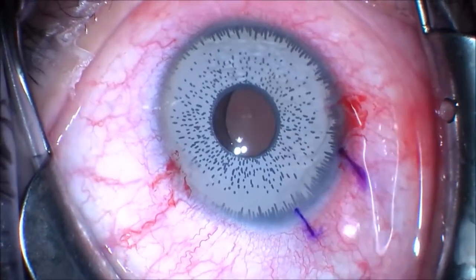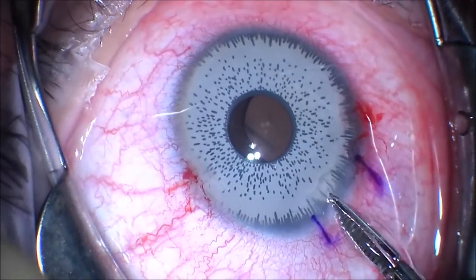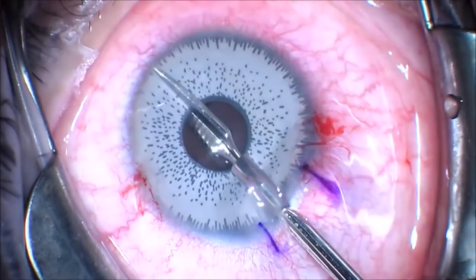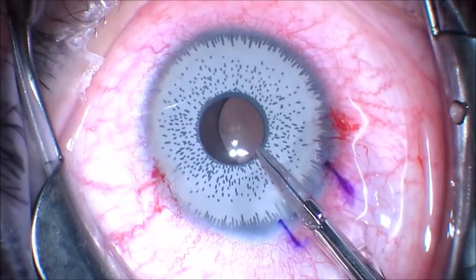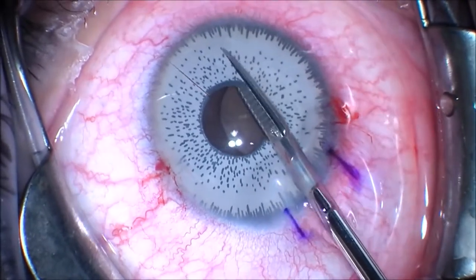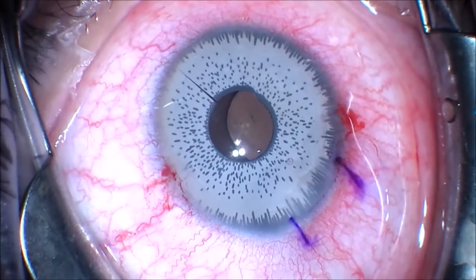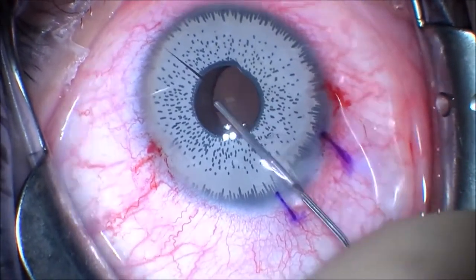The next step is to make a tab 180 degrees away from the corneal incision, as the technique that's been described by others to remove these silicone iris prosthetic implants. And we use a pair of micro scissors here to cut the tab. This gives us a platform to pull the iris implant out of the clear cornea wound.